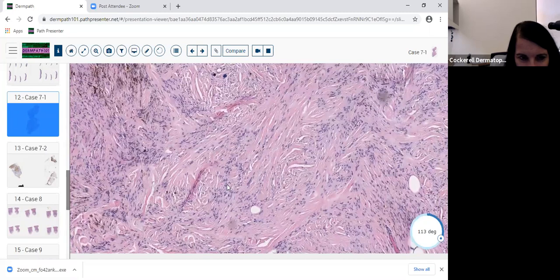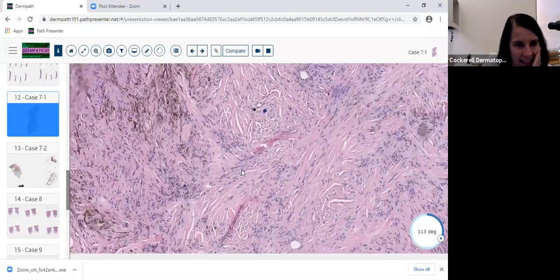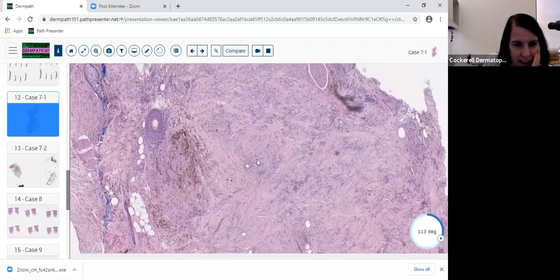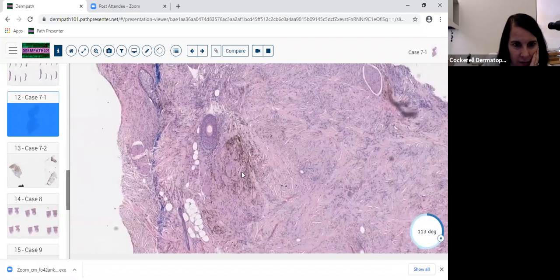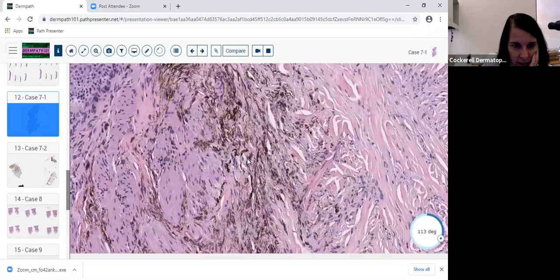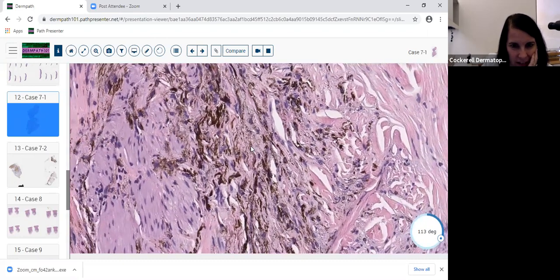And in nevi, so we think that this might be melanocytic because we saw the melanin and they're in those dendritic cells. And when you see dendritic cells, everybody just jumps on a blue nevus, and they should jump on it because that's what this is. This is a blue nevus. And that's the key feature here. If you look at the tumor overall and you start to see areas like this, like it's dead in the middle of the screen, you have to go on high power and start to look at this and say, wait a minute, these are dendritic processes and there's melanin in here. And this looks like a blue nevus in this area.